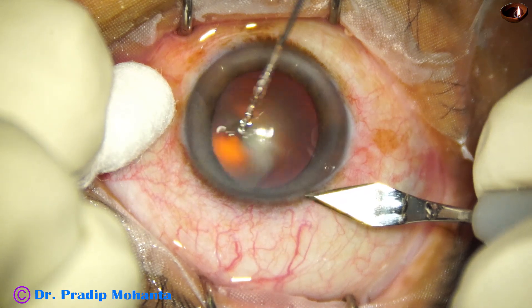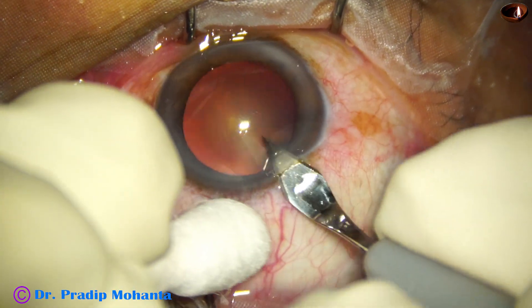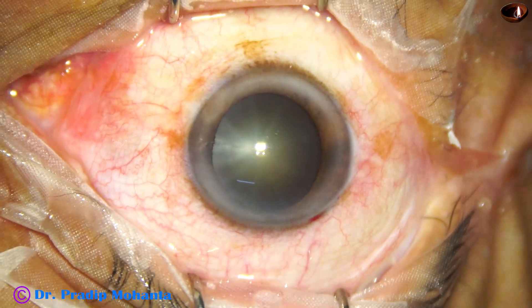Now this is the main incision with a 2.8 millimeter steel keratome. The main incision is made.